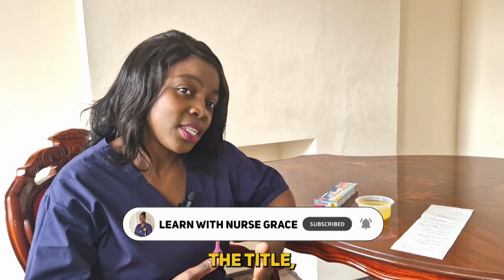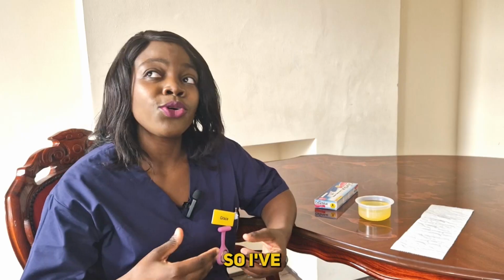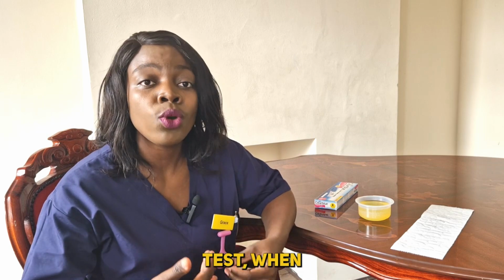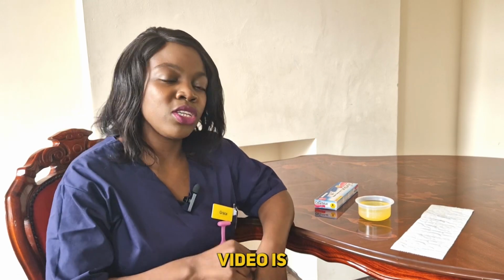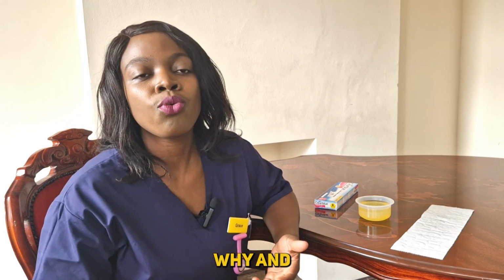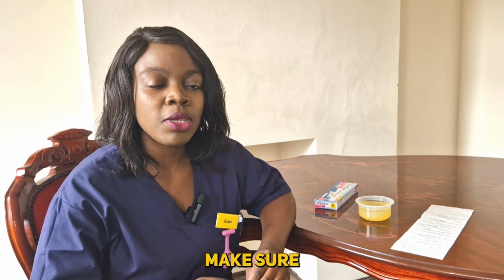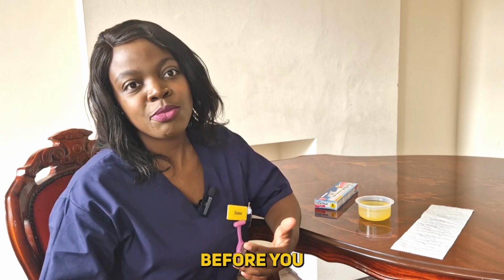So as you can see from the title, I'll be teaching you how to do a home pregnancy test. I've been having people ask me how to do a pregnancy test, when to do it, and why it should be done at this time and this time. So this video is specifically for you who has been asking. I'm going to be teaching you how to do a home test. If you're interested in this video, please make sure that you watch it until the end. I'll just be talking you through what happens before you get pregnant.